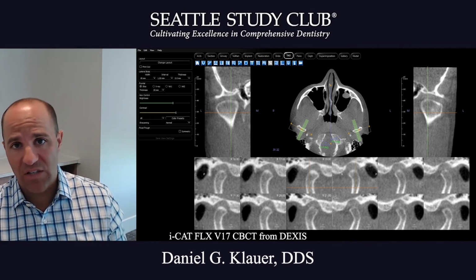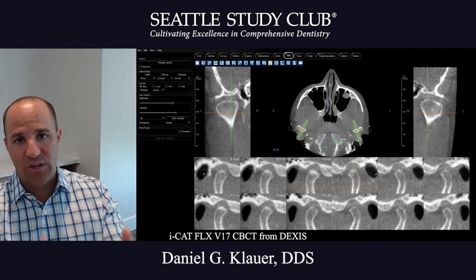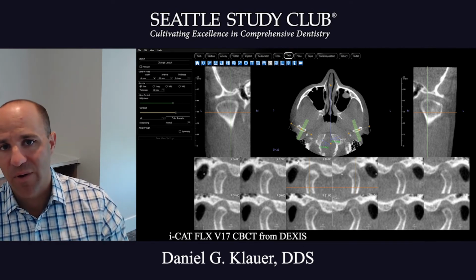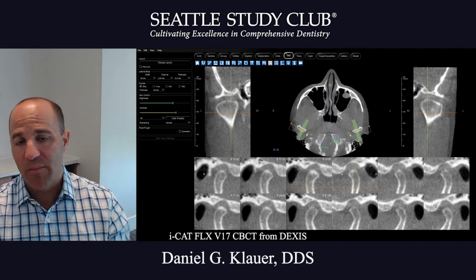It's a great education. It's better than having to go away to a course, and then you're actually learning on your patients. So I would just extend the cost of the radiology read to the patient and tell the patient they're getting it read by a radiologist. And then my training and education would come in reviewing that report.